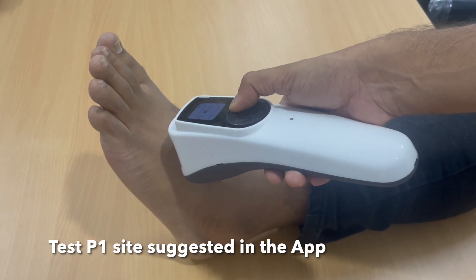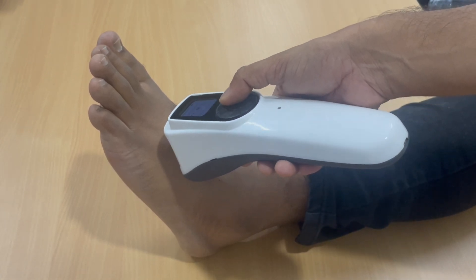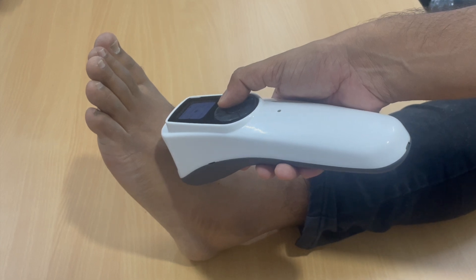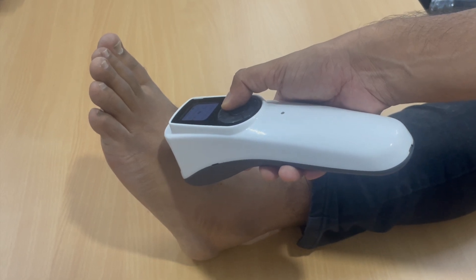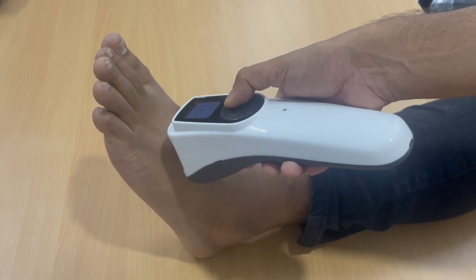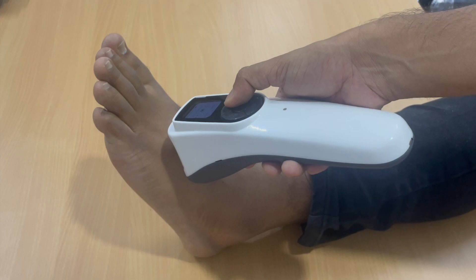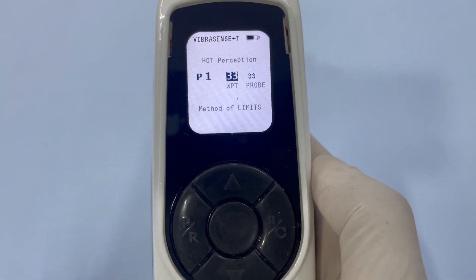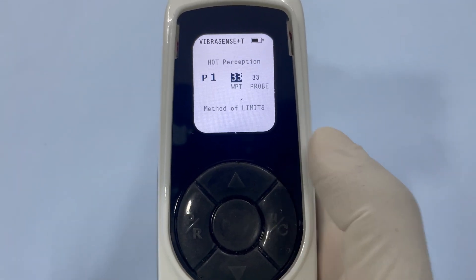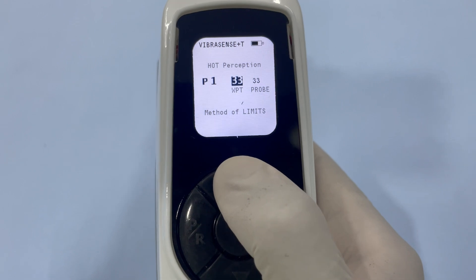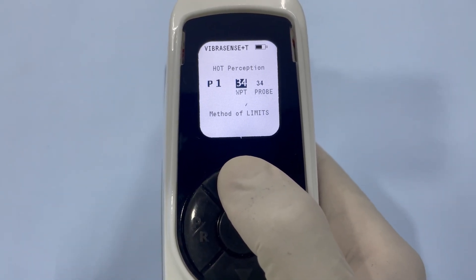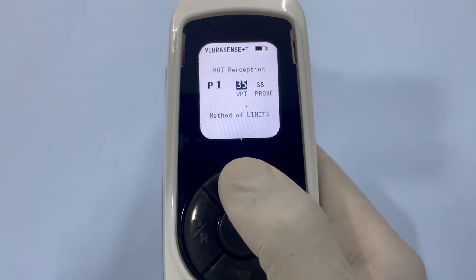Wait until the probe reaches the WPT set point. Place the probe on the testing point P1, ensuring that it is perpendicular to the skin surface and gently touching it. Instruct the subject to indicate when they feel a warm sensation. Gradually increase the probe temperature using the up arrow until the subject confirms feeling the warmth.